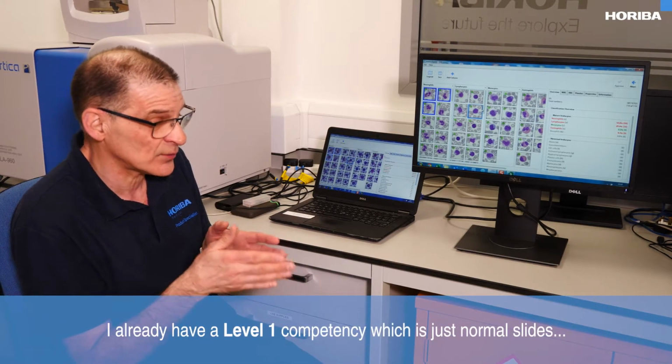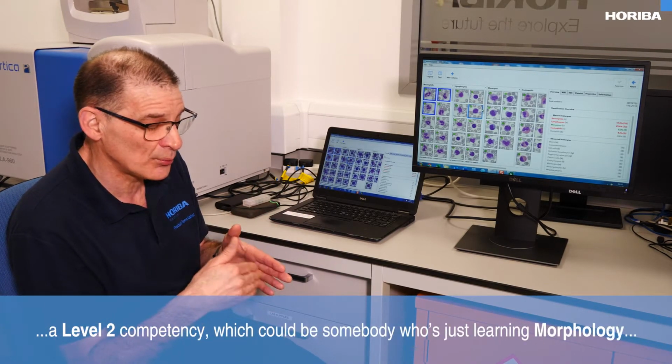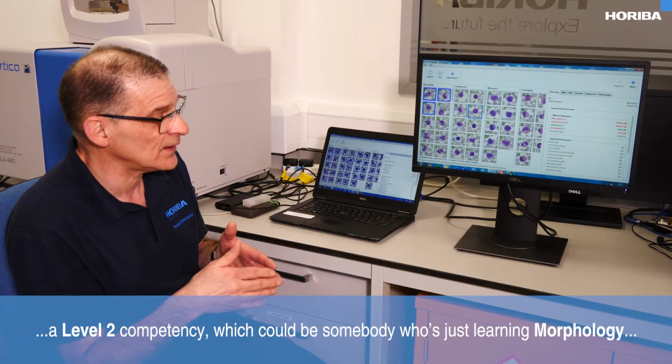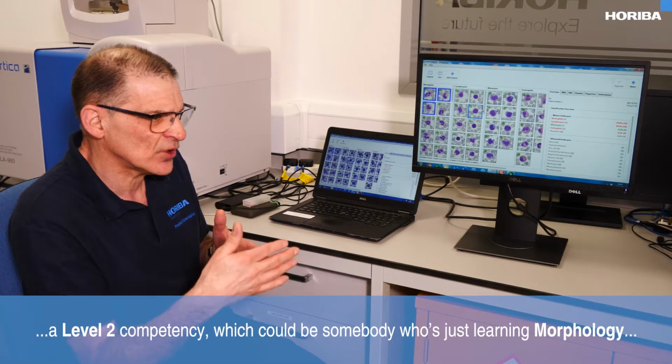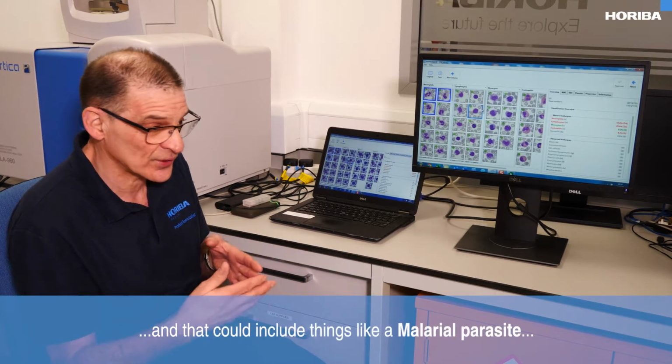I already have a level 1 competency, which is just normal slides, and a level 2 competency, which could be for somebody who's just learning morphology and you might want them to work on their own at night, and that could include things like a malarial parasite, a blast cell, or low platelets.